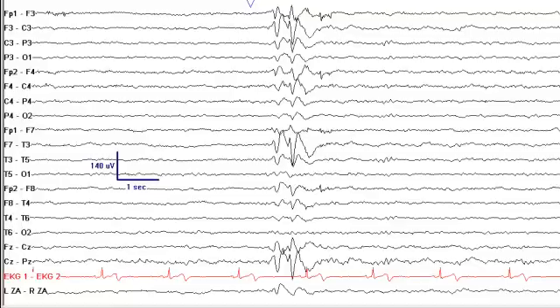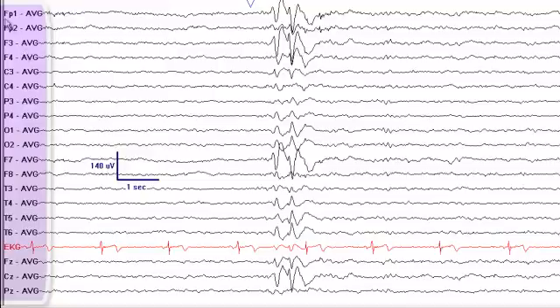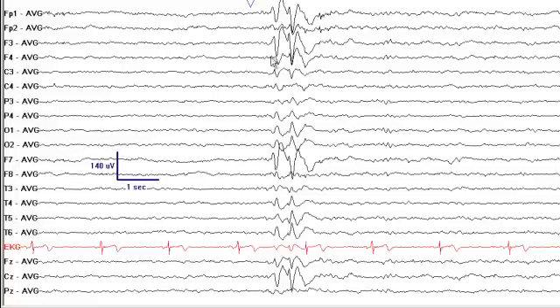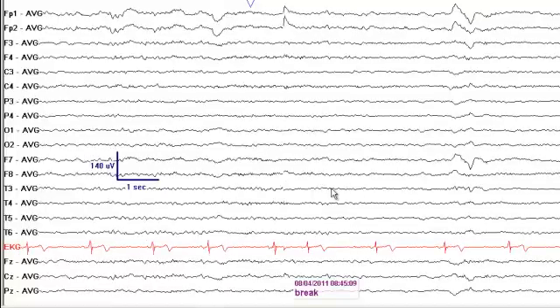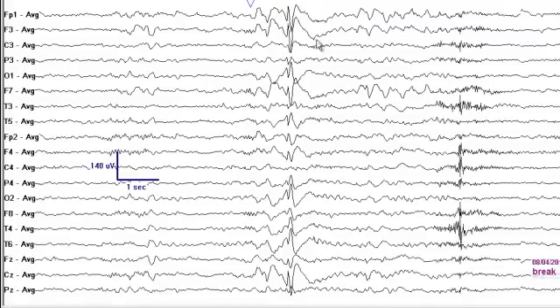Let's change to a different montage — an average reference montage, which compares the left to the right side. Each subsequent electrode alternates between the left and right hemisphere. You see the highest amplitudes of these sharp waves at Fp1 and F3, with the field extending to F7.